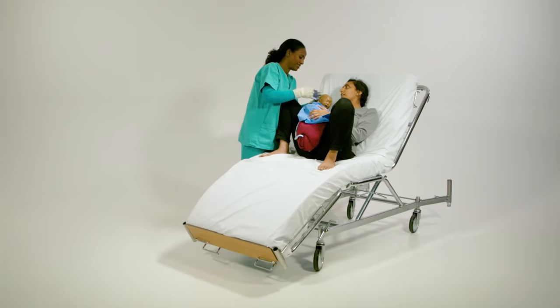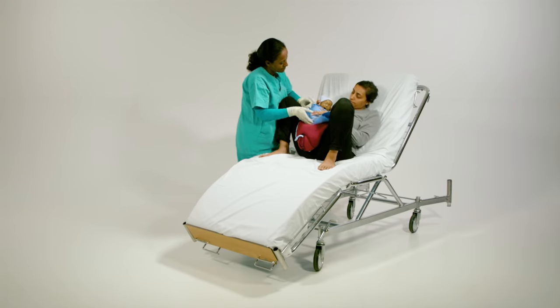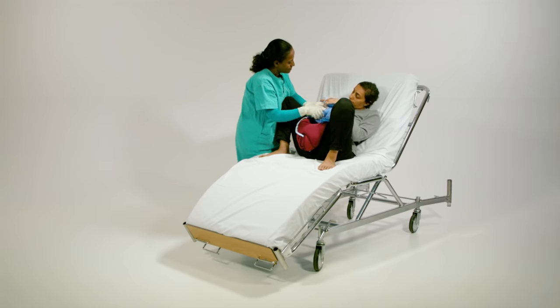Place the cap back onto baby Berthi. Encourage breastfeeding in the first hour after delivery and continue to check on the mother and newborn.